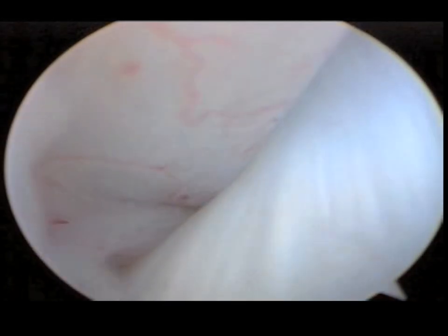This is an arthroscopic video of the progression of ACL disease. This is a normal ligament with nice tightly bound fibers.